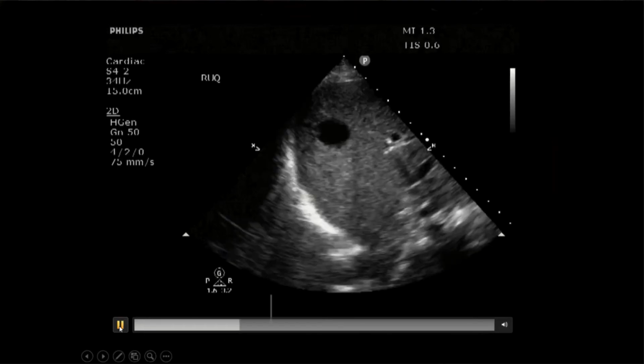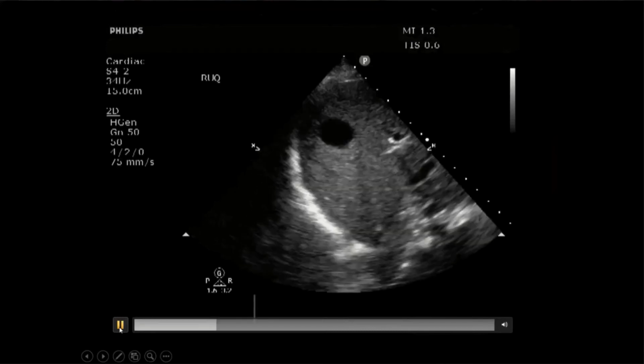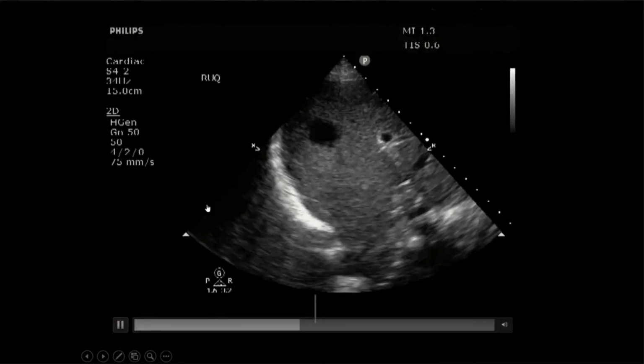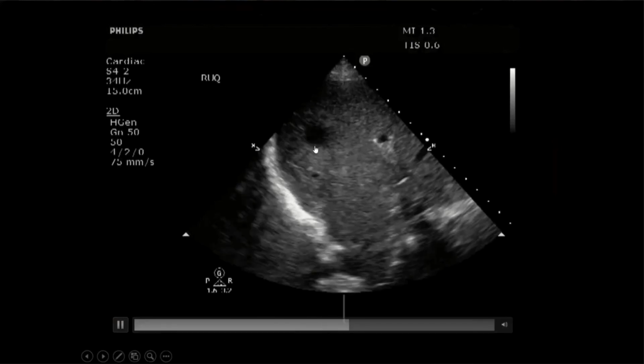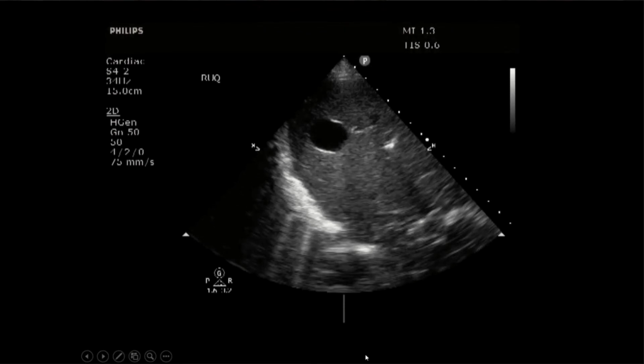What kind of lesion? So this is the liver. We're in the sagittal view. Actually, I think we're in transverse view. What kind of lesion is this? It's round, it's anechoic, it's pretty small. It's got this nice area of through transmission. Yes, it's a cyst. So this is a nice example of a simple cystic lesion within the liver. So it's got nice boundaries, a well-defined posterior wall, and it's got good posterior enhancement or through transmission.